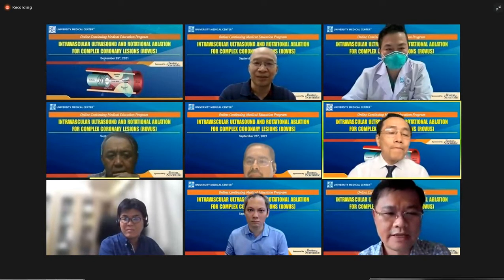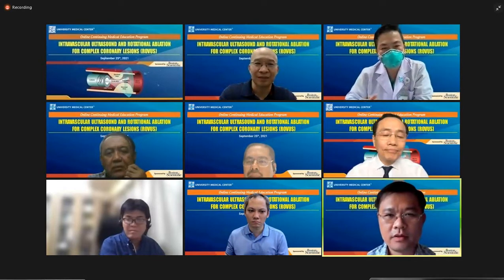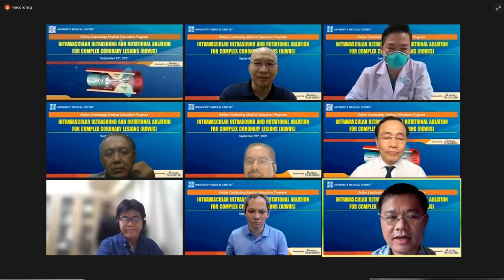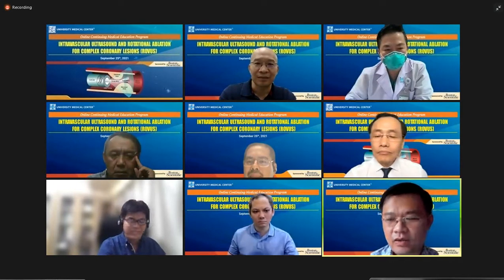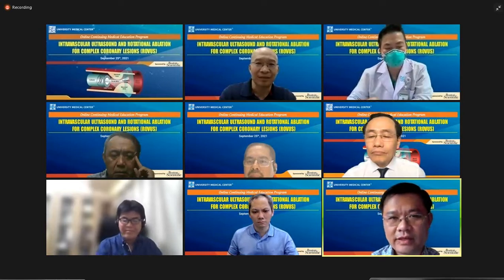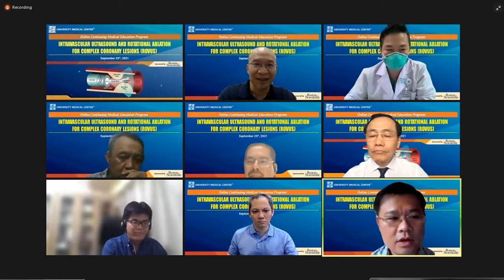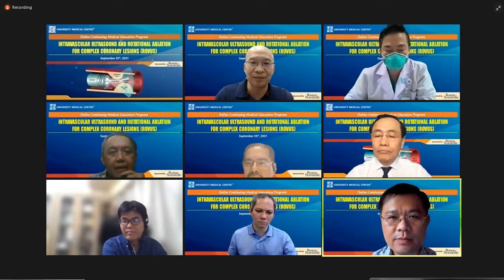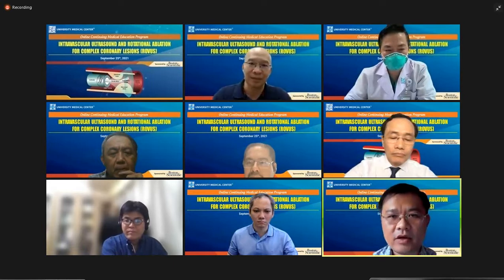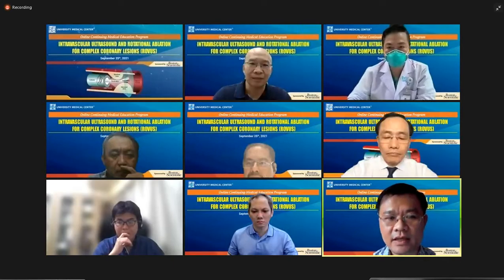Yes. Thank you very much, Chairman. Thank you very much for your lecture, Dr. Choi Chi. I like your presentation very much. I like the reverse guide technique from your experience. I think the role of the double lumen catheter and the shape of the triple guide wires, and your experience, is very important and contributed to your successful case.